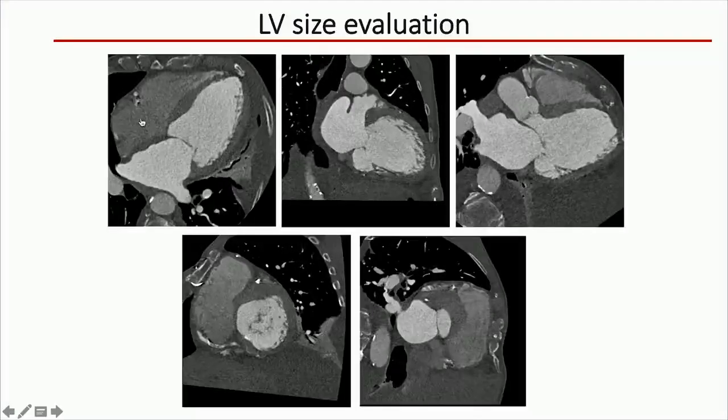We're looking at the apical 4-chamber view and the 2-chamber view. You can see that there is myocardial thinning with an aneurysm at the basal inferior wall in keeping with the prior inferior myocardial infarction. We've got our 3-chamber equivalent view with the outflow tract being visualized and also the aortic valve. And here we've got some short axis views as well.